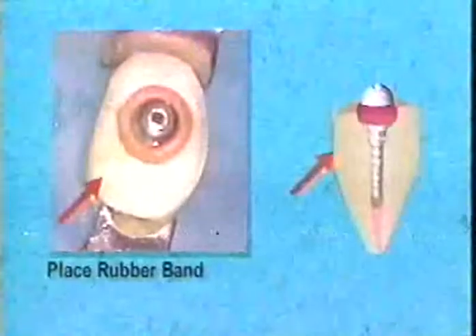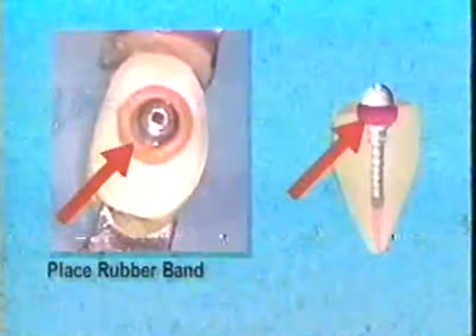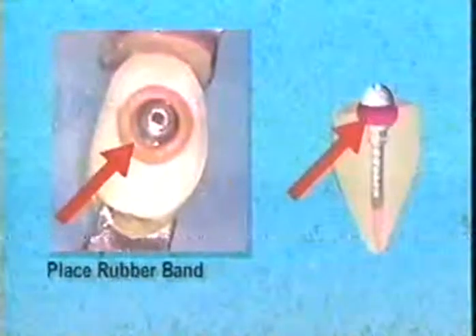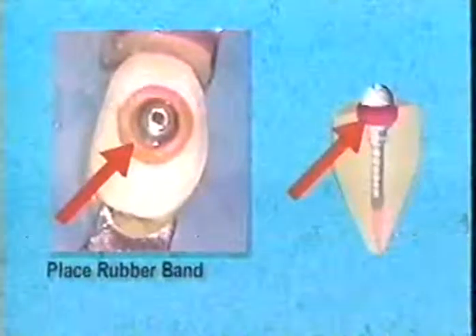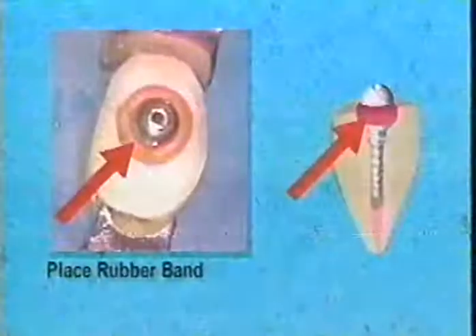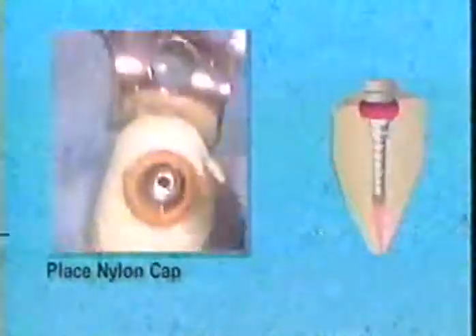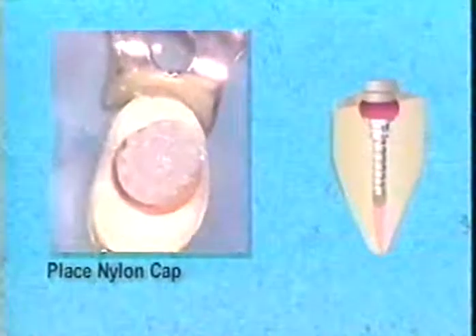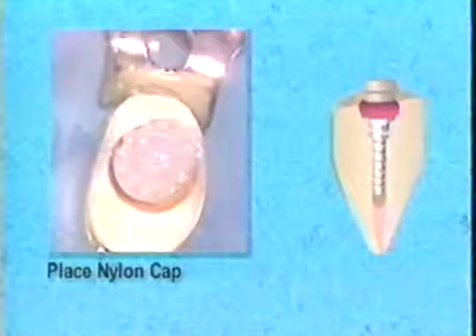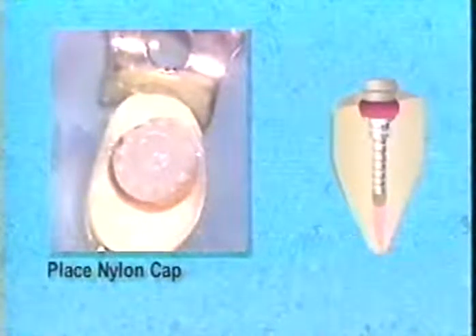Incorporation of the nylon attachment cap: It is important to first place the rubber band on the head of the post. If the rubber band is not in place, there is a risk that the cold-cured acrylic could lock in under the coronal ball of the post head, making the denture difficult to remove. The nylon cap is now placed on the ball of the post. As an added feature, we will continue to show this procedure with the new Easy Change Keeper and Cap Insert System, which may be purchased separately.